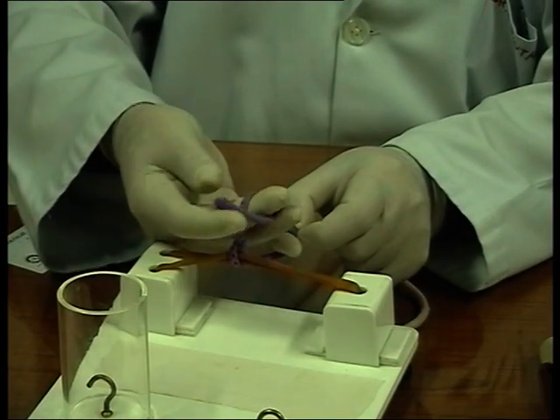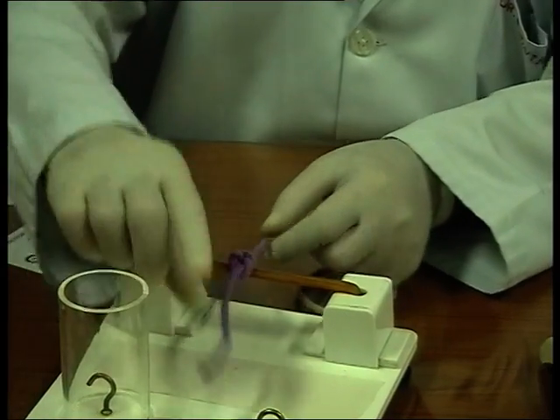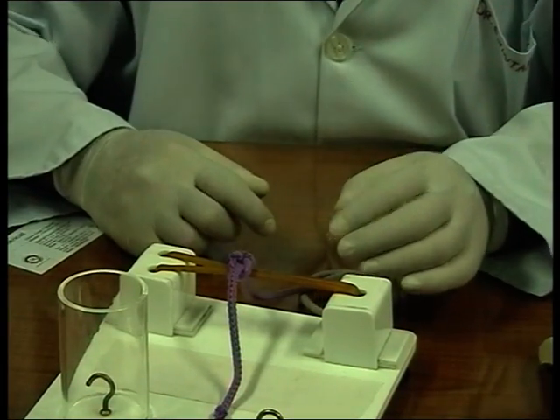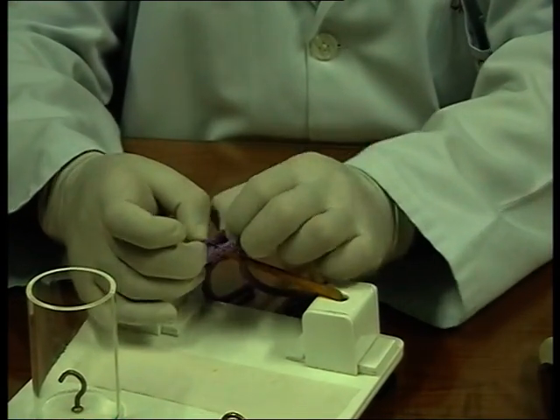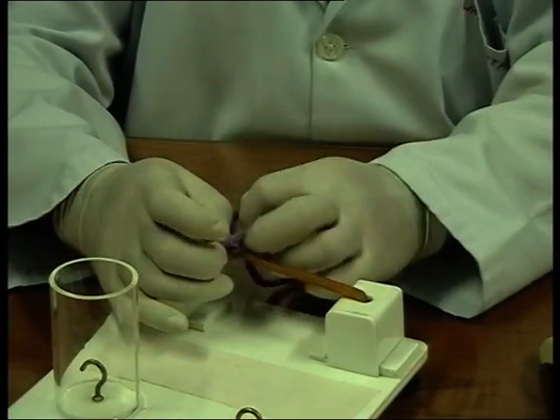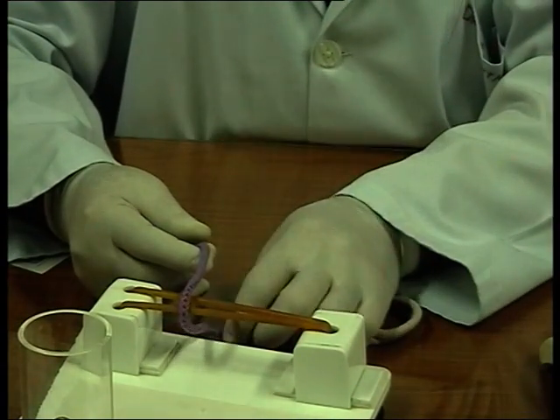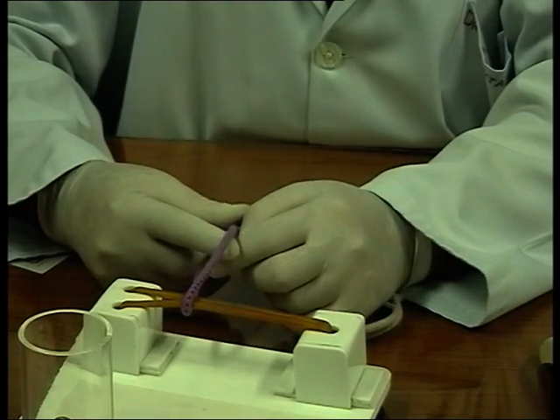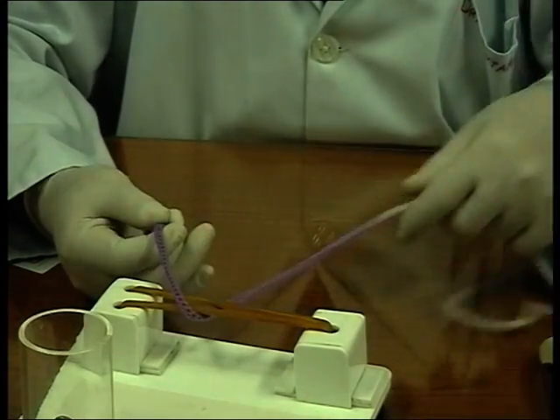Between the middle and ring, I take it through the loop and cross back. That's a surgeon's knot. The third knot, which even if you don't remember, I don't mind, because these two are the basic bread and butter knots for anybody who's pursuing surgery as a career. Surgery includes surgery, orthopedics, obstetrics, ophthalmology, ENT, everywhere you have to put the knots.